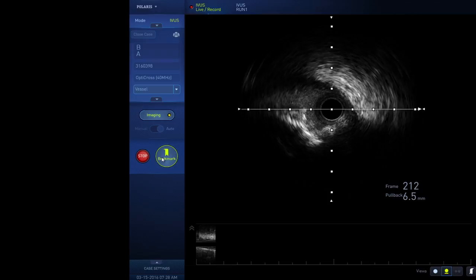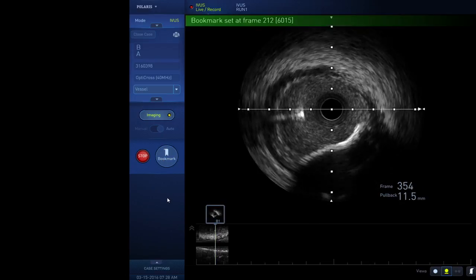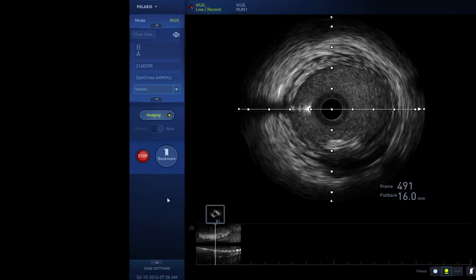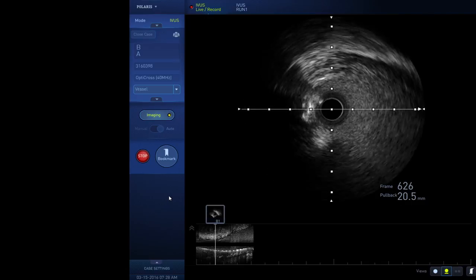Okay, this is the distal left main. Look at that calcium. More than 180 degrees is what makes it heavy calcium. It's almost 270 degrees. Now we are out proximal. It is okay, just a short eccentric lesion. But I think we did not cross completely anyway.